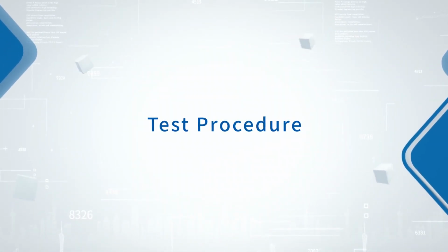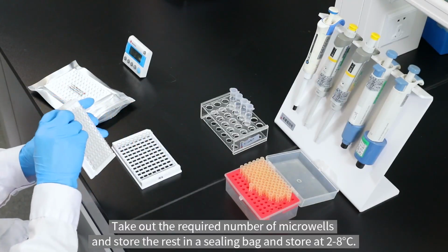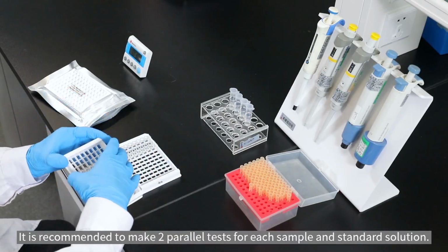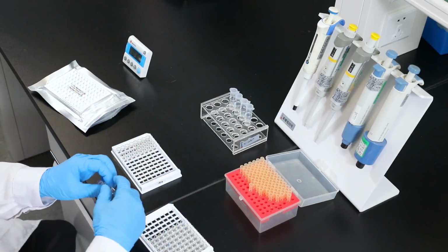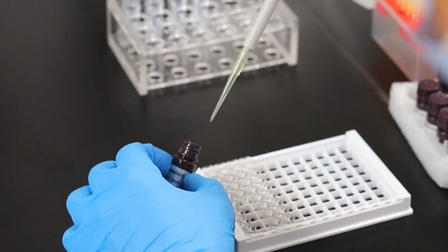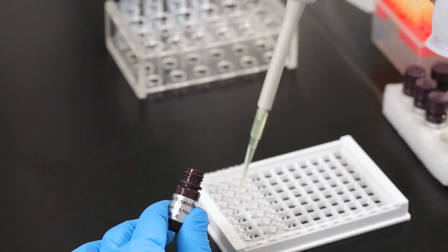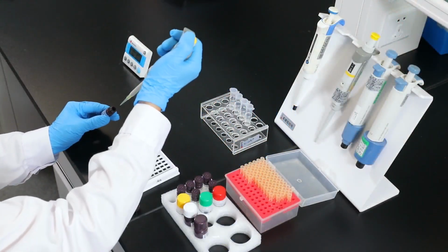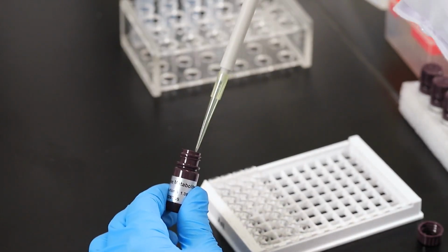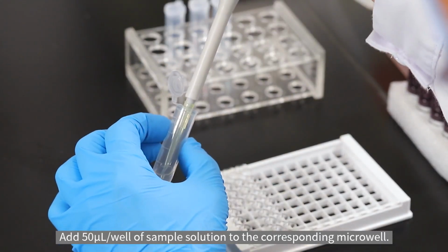Test procedure. Take out the required number of microwells and store the rest in a sealing bag at 2 to 8 degrees Celsius. It is recommended to make 2 parallel tests for each sample and standard solution. Add 50 microliter per well of standard to the corresponding microwell. Add 50 microliter per well of sample solution to the corresponding microwell.